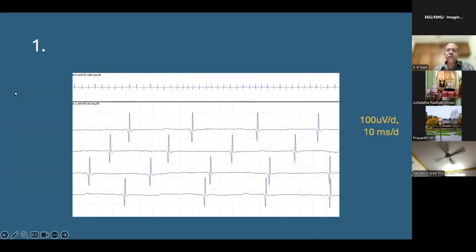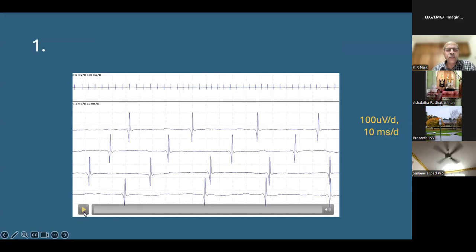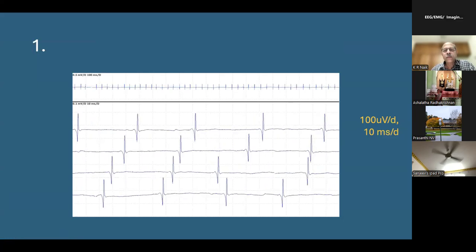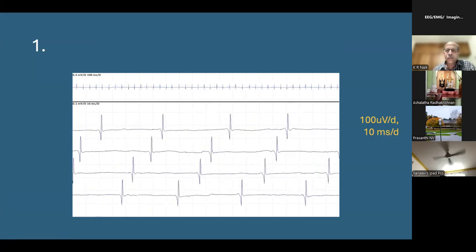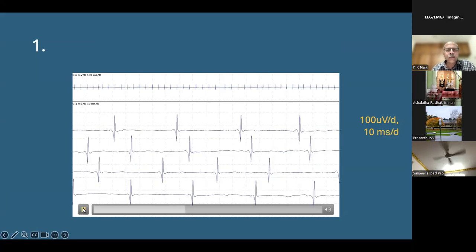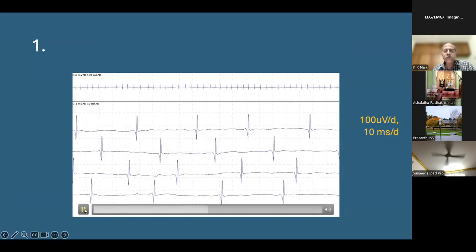So with this background, I'll start with around 8 or 10 videos of EMG. This is the first example. You can note down your answers.